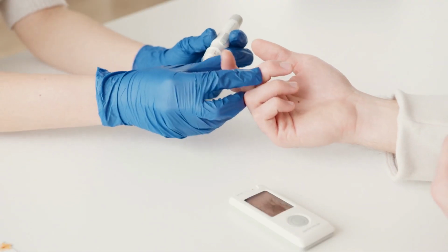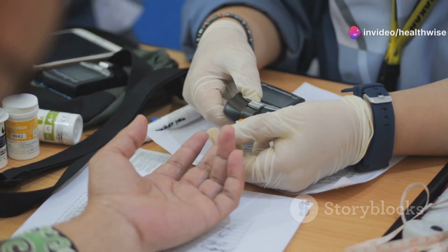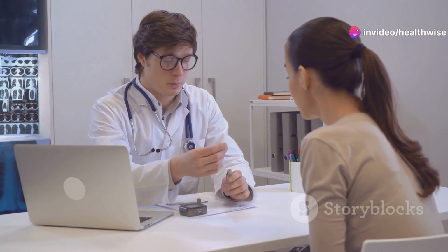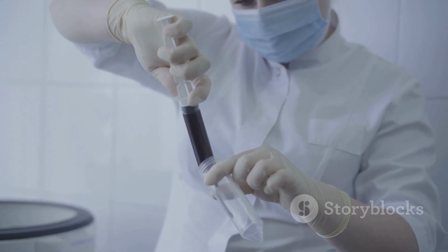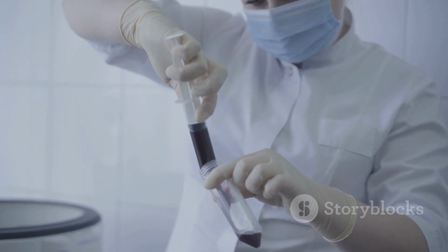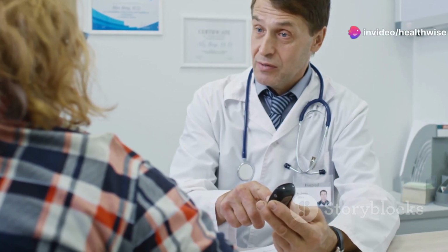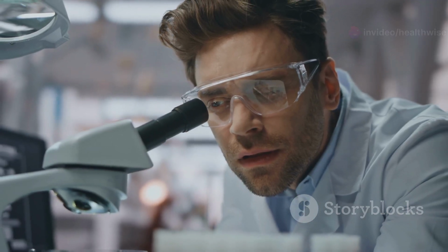Now, any method used for blood glucose estimation can also be applied here. However, keep in mind that the glucose level in CSF is typically lower than in blood and may be further reduced due to disease. Therefore, the volume of CSF used in the test should be twice that of blood used in the same procedure. For a detailed method, refer to the section of chemical pathology on page 265 in your textbook. Speaking of diseases, let's look at some CSF findings in various conditions.